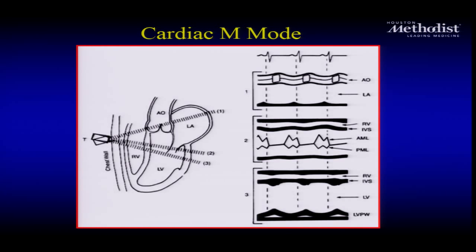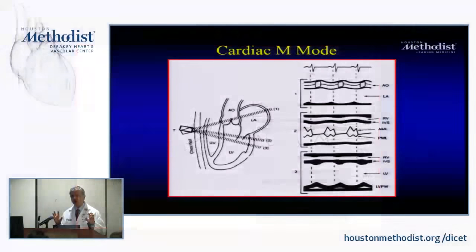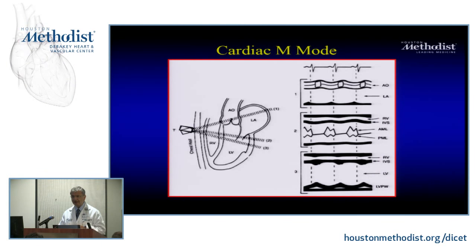And M mode has great characteristics, actually, and we always talk about it in the lab, how they differentiate all these septal motions that are quote-unquote paradoxical. There are 7 of them. And if you're really good, you should be able to draw them, okay? Draw how the septum moves in each one of the paradoxical post-surgery, volume overload, pressure overload, a constriction, etc., etc. And I would push you to do this. As cardiologists, you should be able to actually take a QRS, PQRST, right?